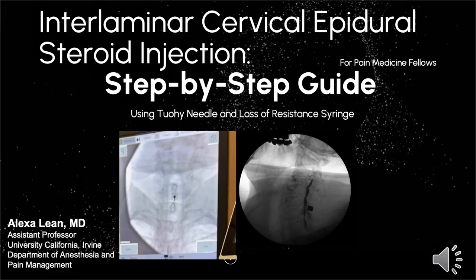Hello, my name is Dr. Alexa Lean, and today we'll review safe performance of interlaminar cervical epidural steroid injections. At the fellow level, the focus is not just how to do the procedure, but how to avoid mistakes that cause harm.